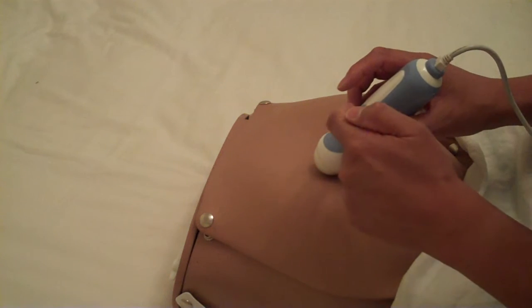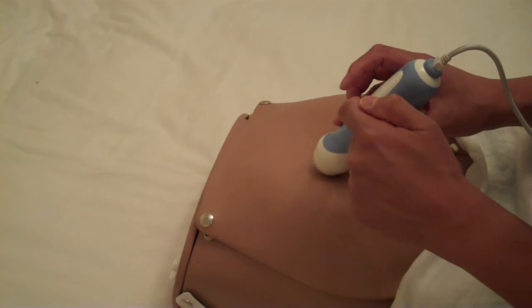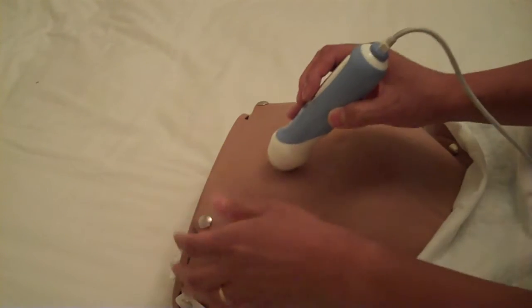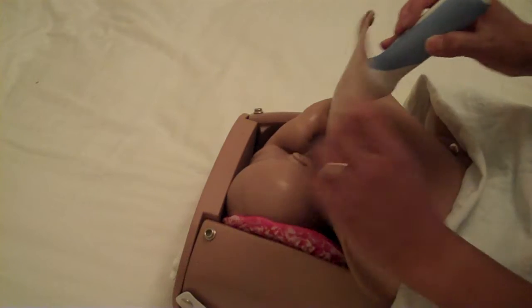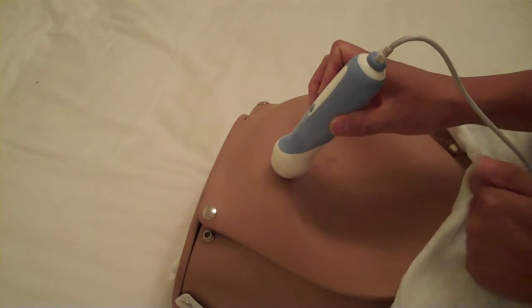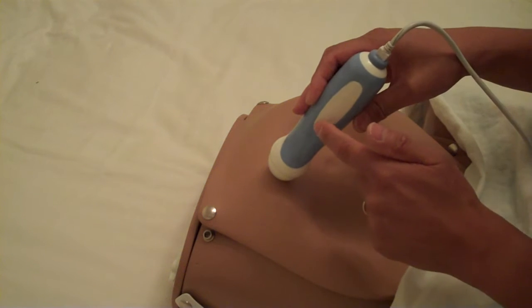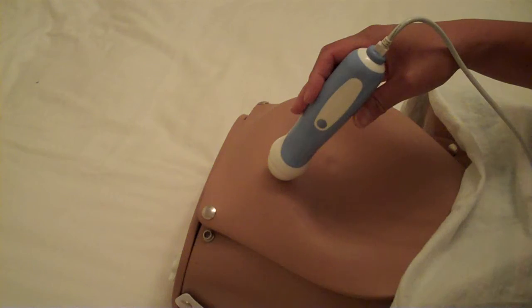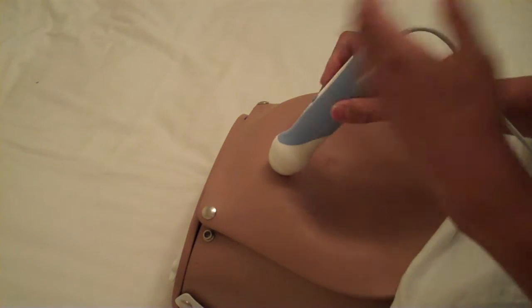But very important thing is to keep the dot pointing up all the time, and I'll tell you why. Once you find whatever it is that you're interested in, let's say the baby's head, okay? Then you can tilt the probe, you can turn the probe so the dot is pointing this way, which is the mother's right side, okay? Don't turn it the other way, it's just a convention.